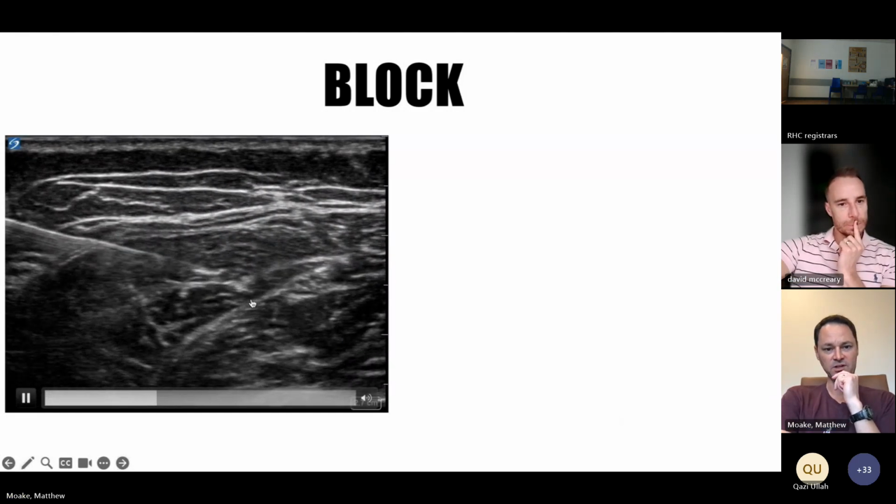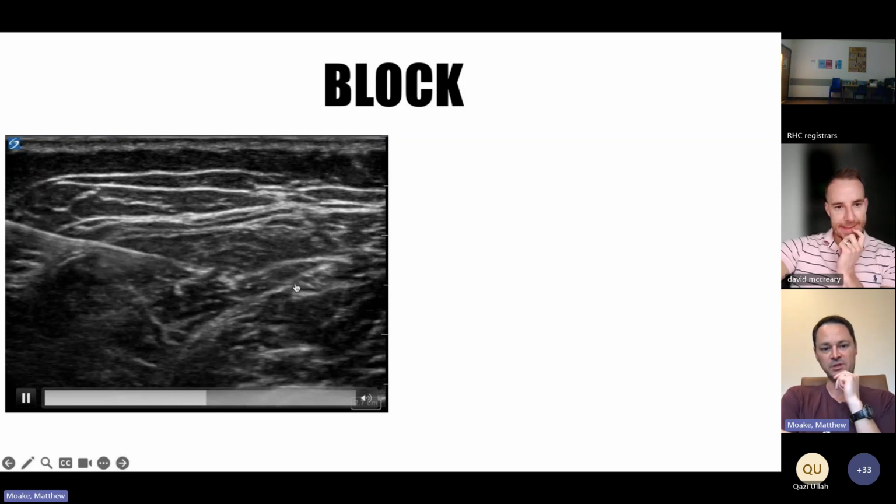Here we're a little bit high. We're coming in right at the nerve. I'm going to try to slowly manipulate down to get below it. Little kiss on the nerve there. We'll ideally avoid that. Subtle injection there, just right at the nerve, and you already see it starting to spread around. And then here towards the back end, great view of the needle, that reverberation artifact, big anesthetic volume around it. And this will give you a really nice dense block.